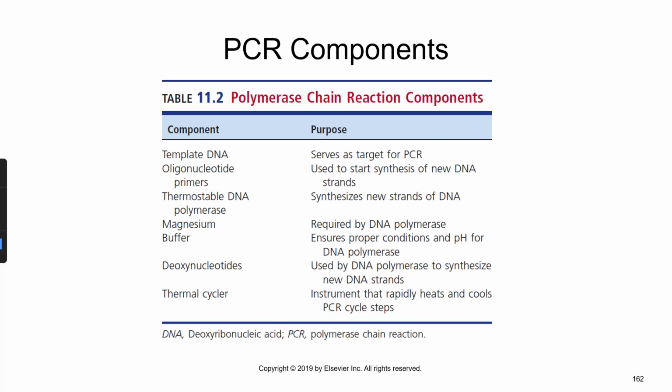So you can pause the video and read through what each one of these is and what it does in this reaction. You will be tested on these individual components of PCR. This is pretty essential and vital to the understanding of how molecular diagnostics plays a role in identifying bacteria. So that's something that you want to do.